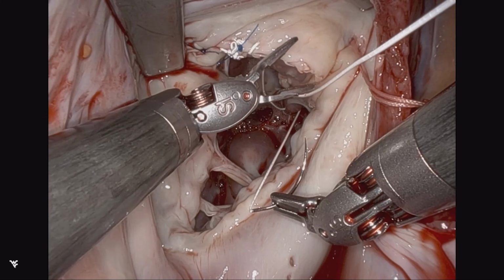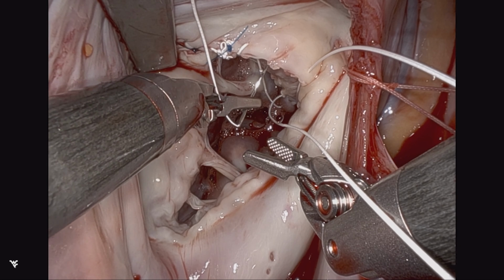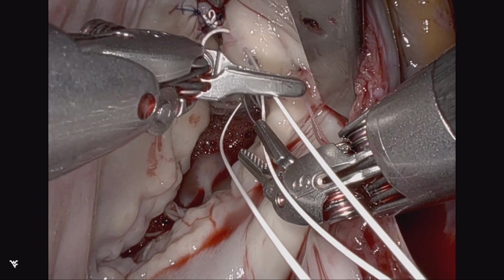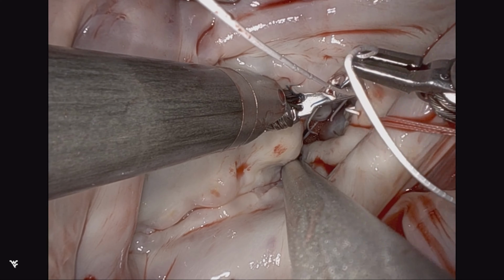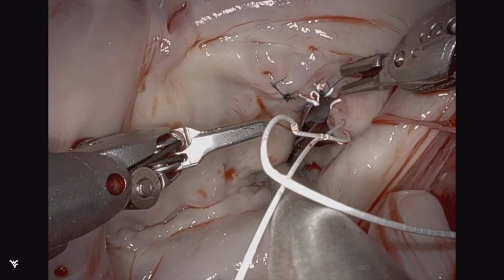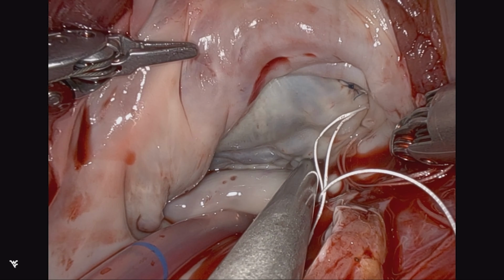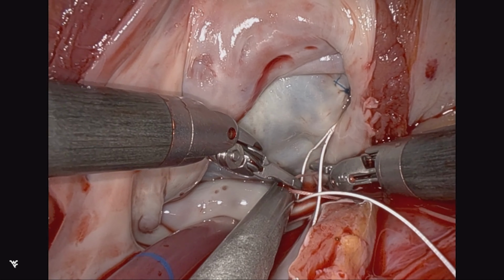Therefore, a second cord is utilized to support P3. And a double loop technique, as previously demonstrated, will then support now P3. Given the fact that the anterior leaflet is relatively normal, we're able to create a very nice coaptation. And one can appreciate that the annular size remains fairly large.